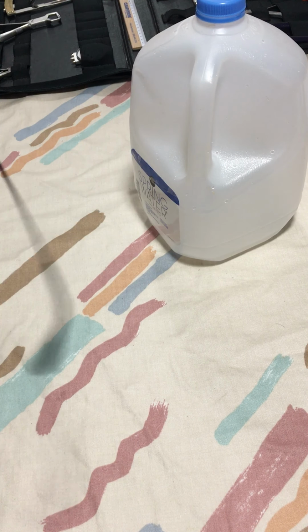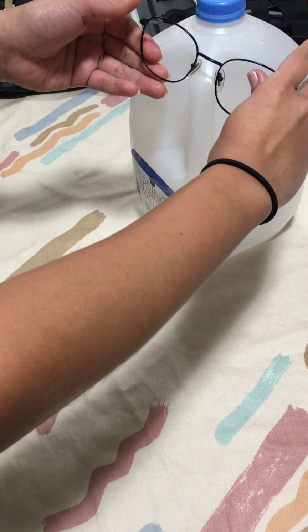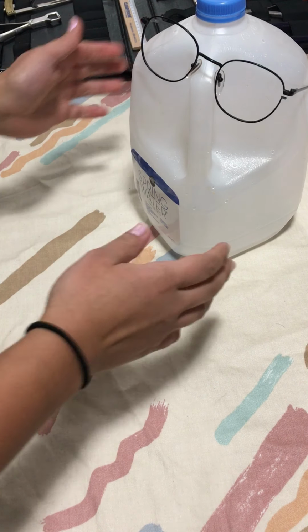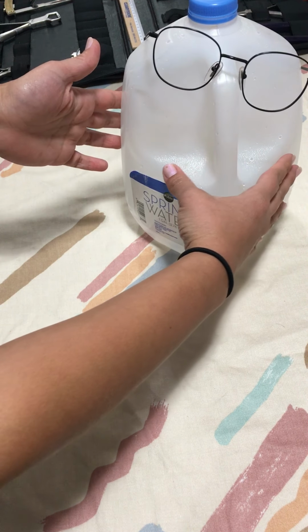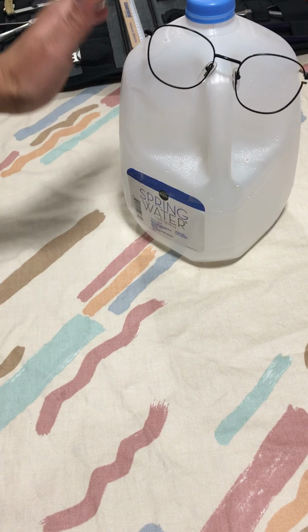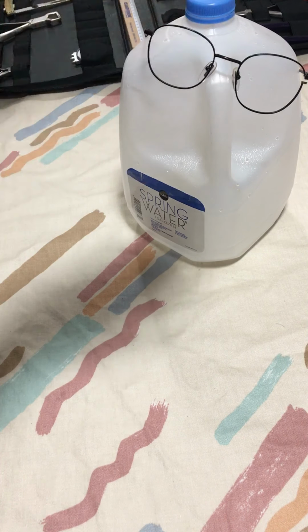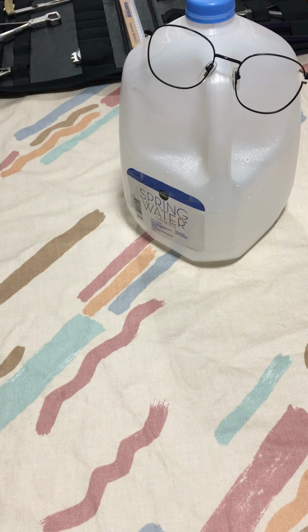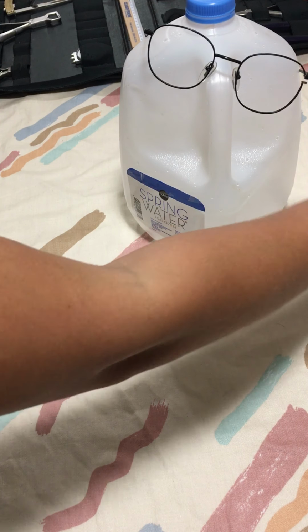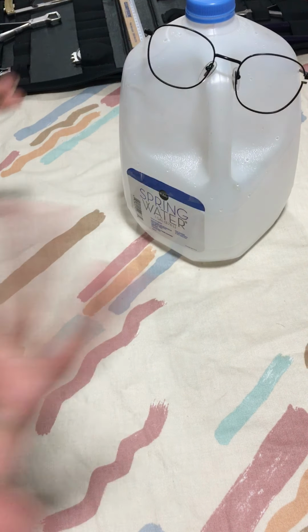Now we're going to be working with temple parallelism. So I am going to be putting it on the patient's face first. What I notice is patient comes in and I notice that this side of the frame right here, this side, it looks like it's more up than this side. This side looks like it's falling on this side. So what I can do, I have two options. I could either raise this side upwards or lower this side downwards, okay, in order to fix the misalignment.